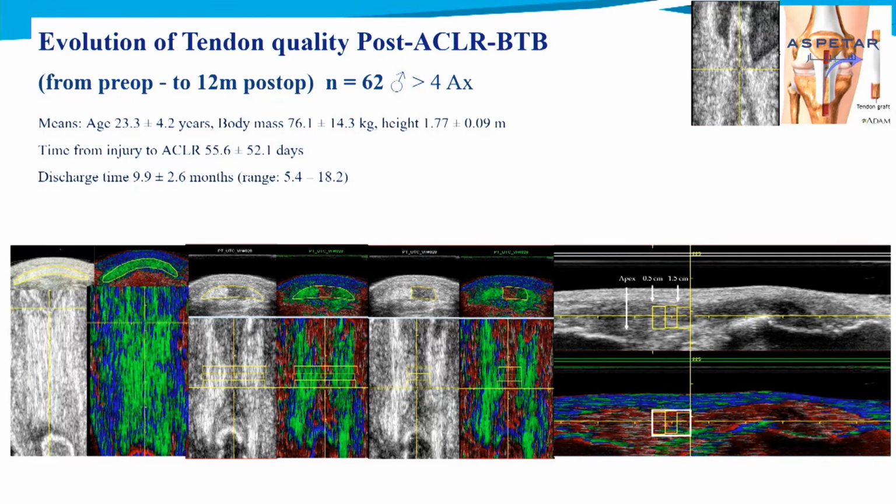So here, you can see that the first picture is a regular unharvested tendon. The second picture in the middle is the whole harvested tendon, including the remaining tissue and the harvest area. And the third contour gives only the gap, the donor site, okay? And in this study, I didn't consider the whole tendon. I considered only between 0.5 and 2 centimeters of the tendon, so the information is at the center of the tendon.